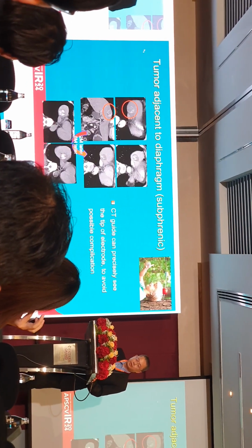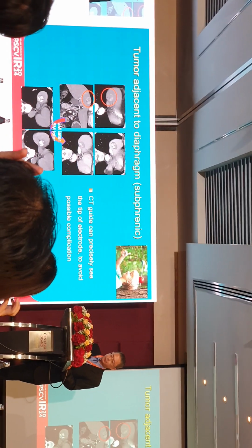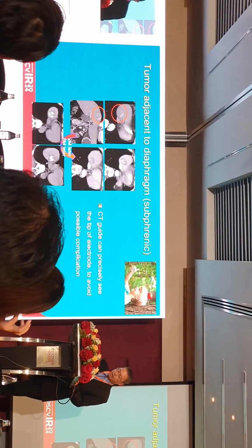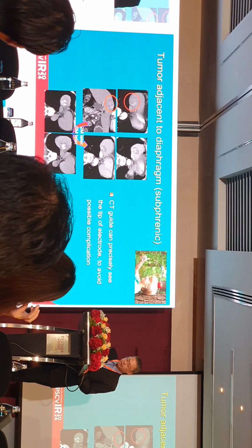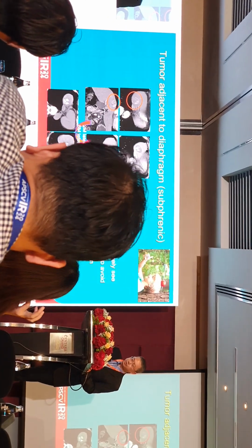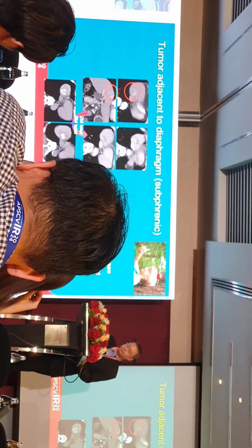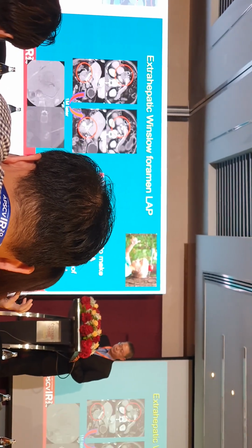And for the liver dome near the diaphragm, after the lipiodol TAE, there's dense lipiodol retention in the tumor, and I use the off-plane approach technique from inferior to superior, and precisely insert the electrode into the tumor. After ablation, 2 months and 8 months later, the tumor was completely ablated. No injury to the diaphragm, lung, or heart.